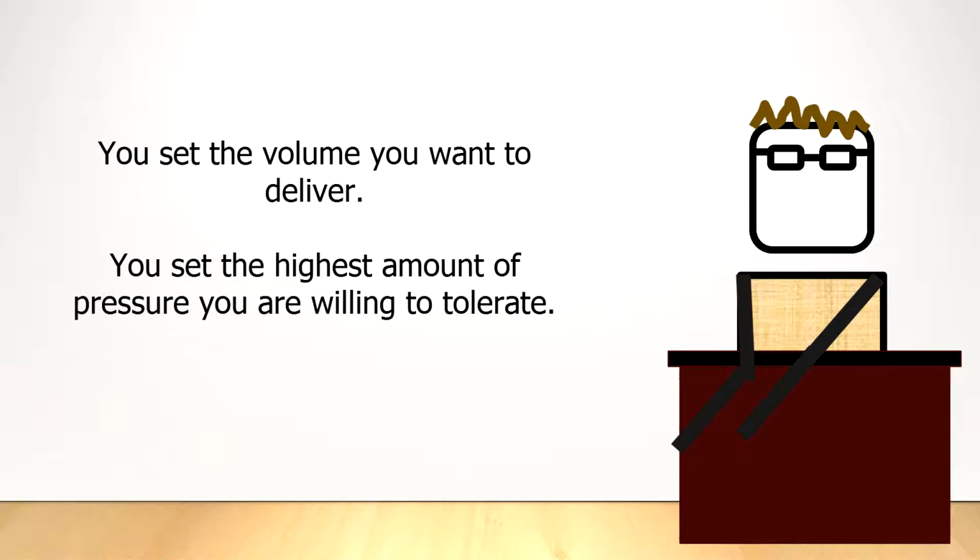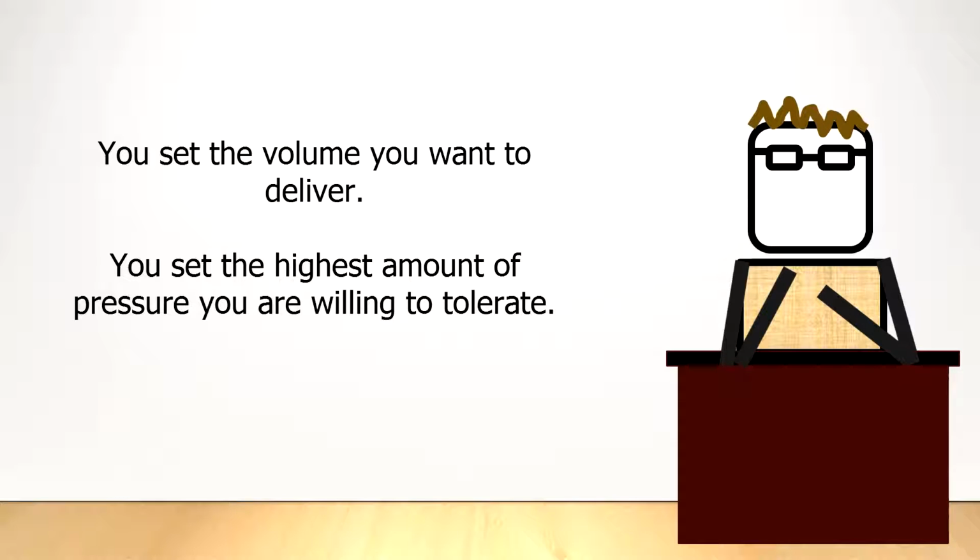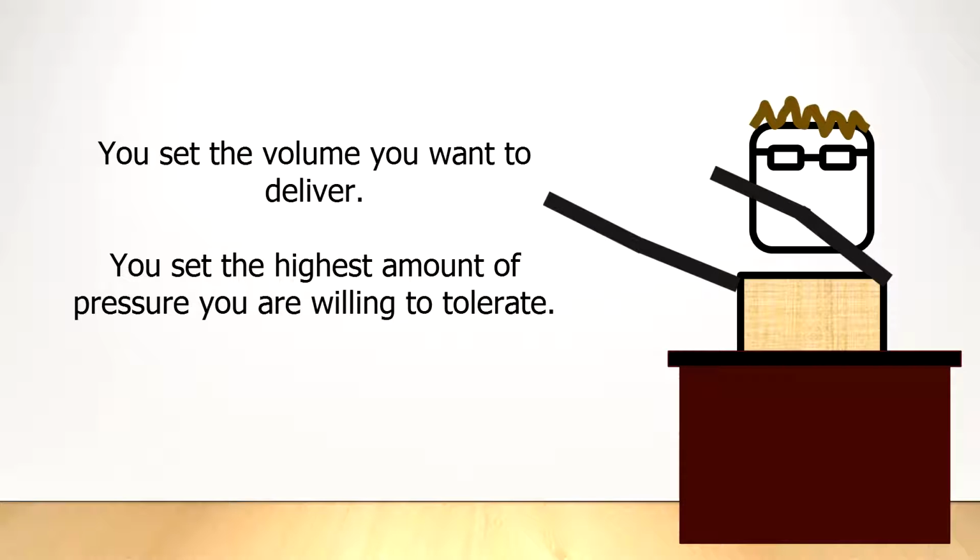As a general rule, you can consider this mode of ventilation, which you will probably see fairly frequently, as simply trying to find the best of both worlds. The user will set the desired tidal volume and the rate, and then establish a pressure alarm limit instead of trying to set the pressure.